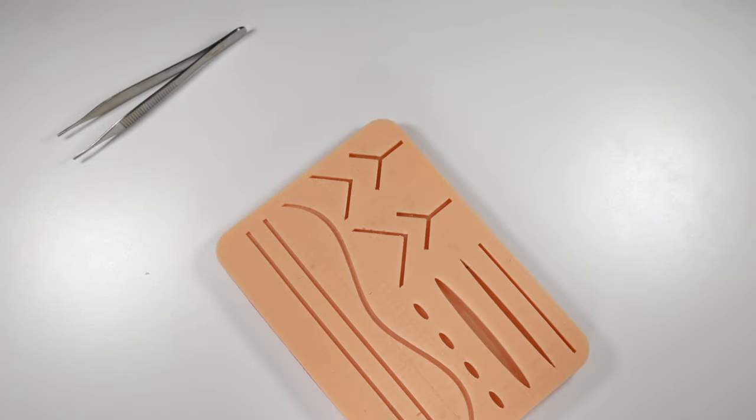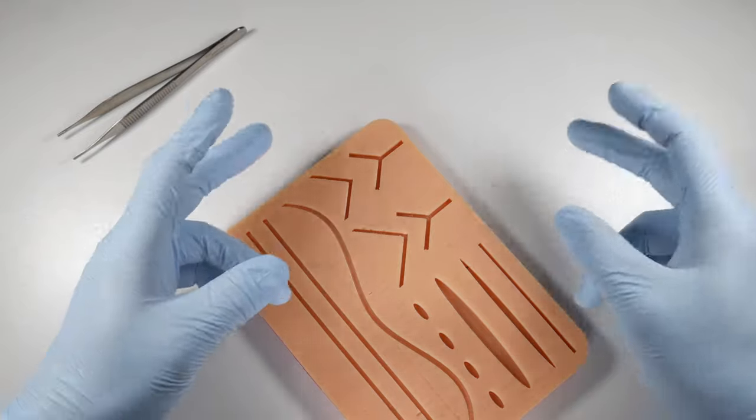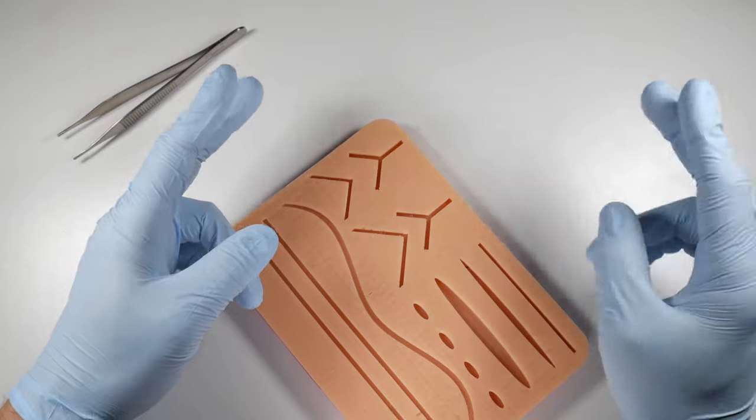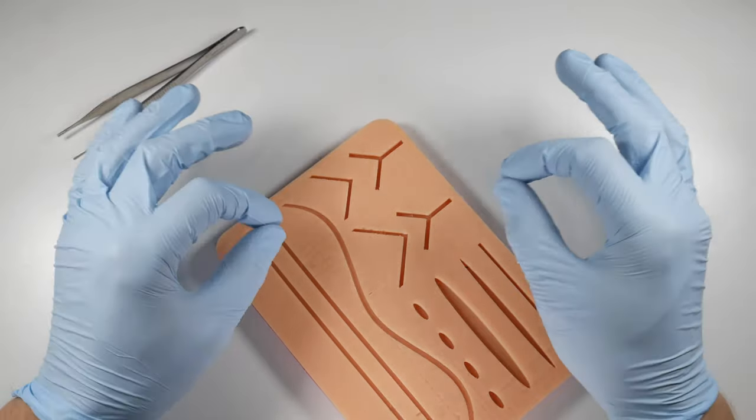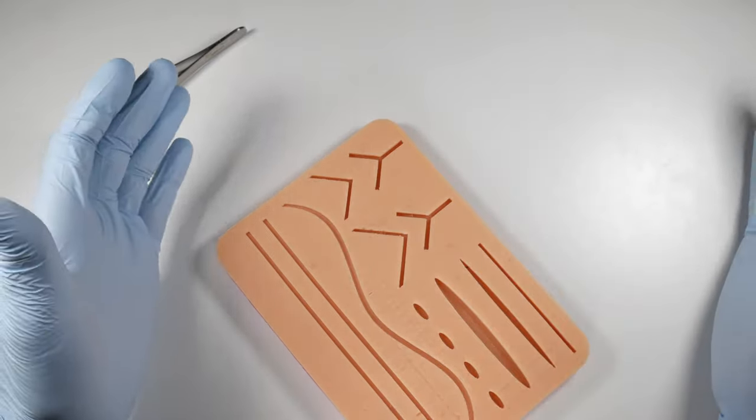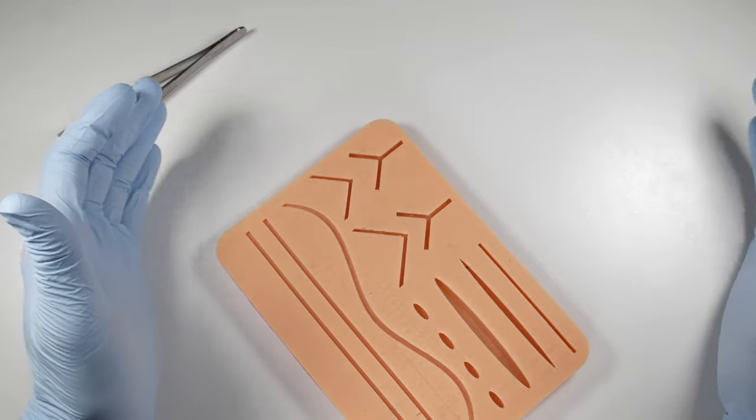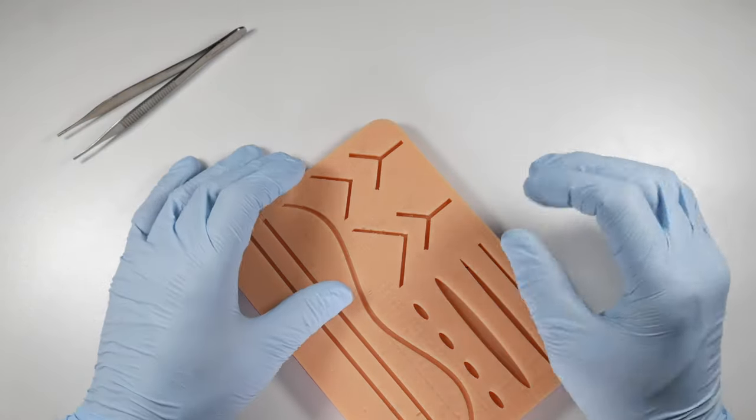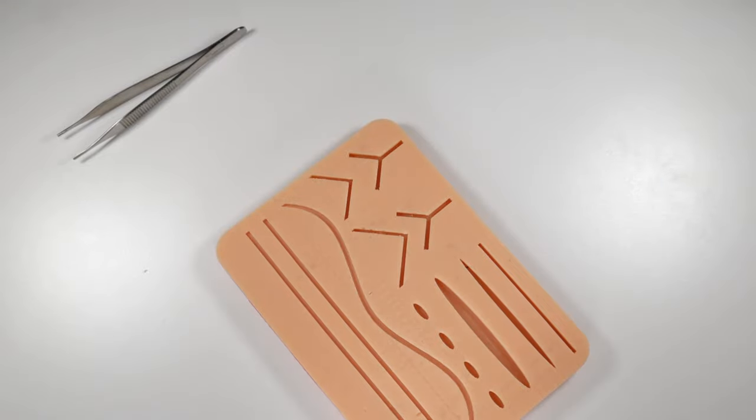These sutures are often fairly long when you take them out, which can make them difficult or cumbersome to handle. Just snip it off. Take off a big chunk of it. Only have what you need. You might only need to place one or two sutures. Why have a whole big long arm's length of suture material there to deal with when you're trying to put in one or two simple interrupted sutures.